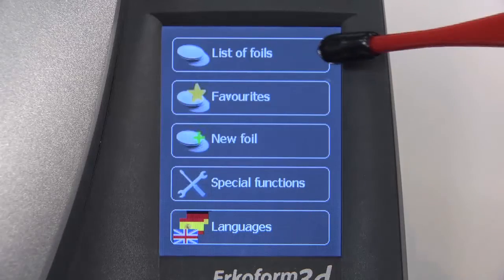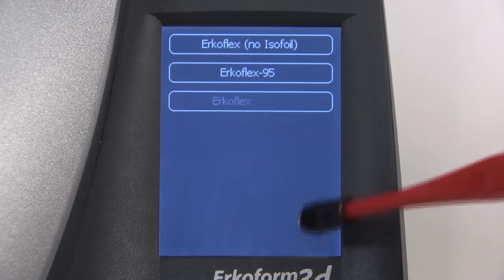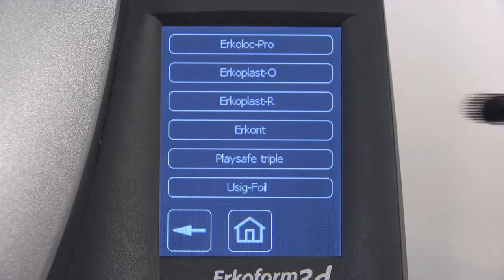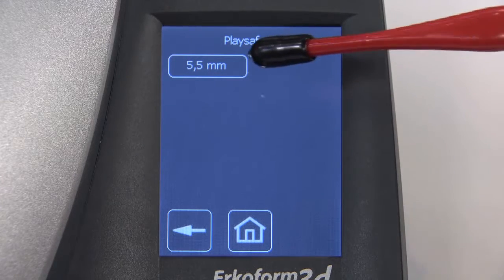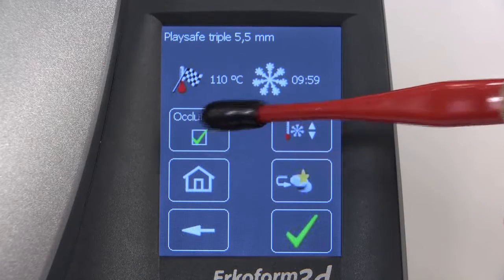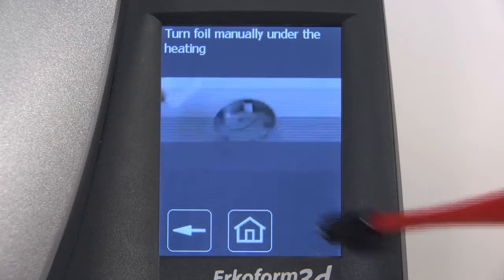Begin by clicking the on-screen list of foils button to find the desired foil. Click the right arrow button on the bottom until you reach PlaySafe Triple. Select PlaySafe Triple and the 5.5mm option. Click the Aquiform checkbox. Once you verify the information at the top of the screen, click the green checkmark.